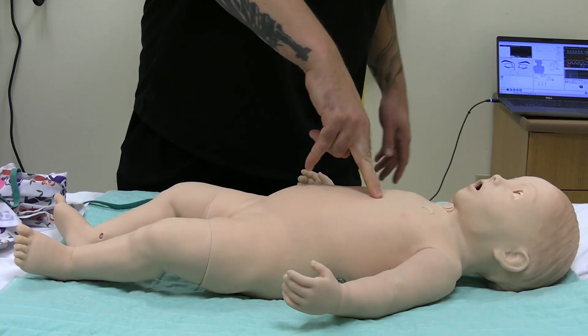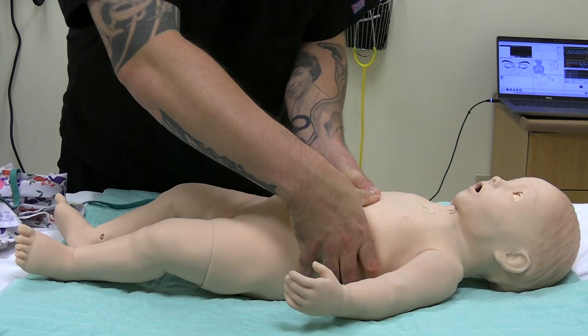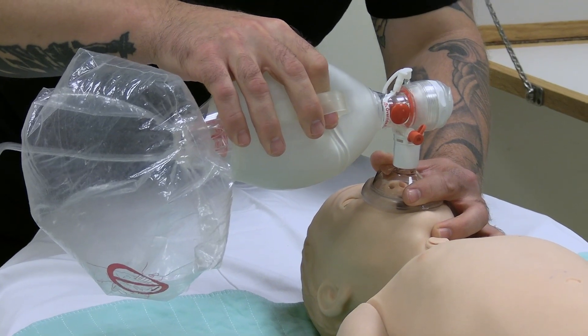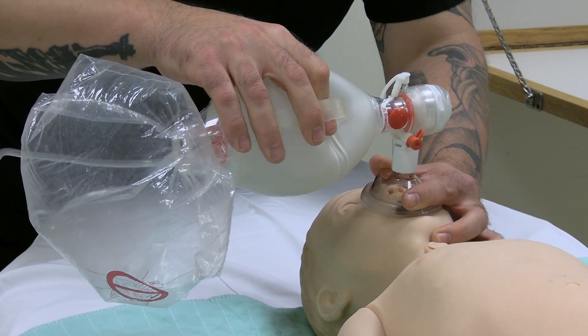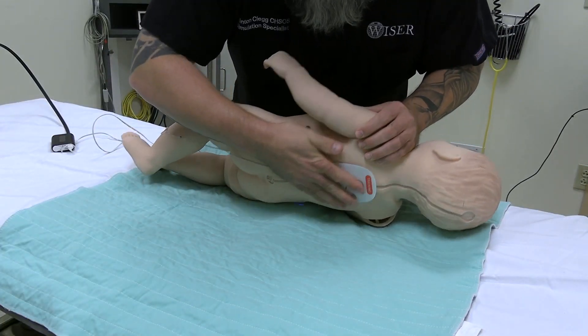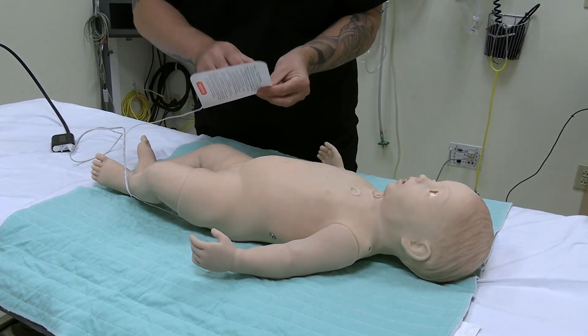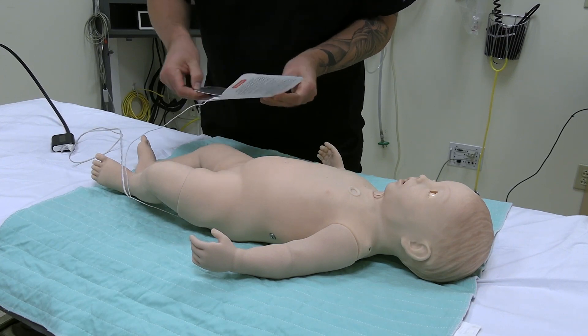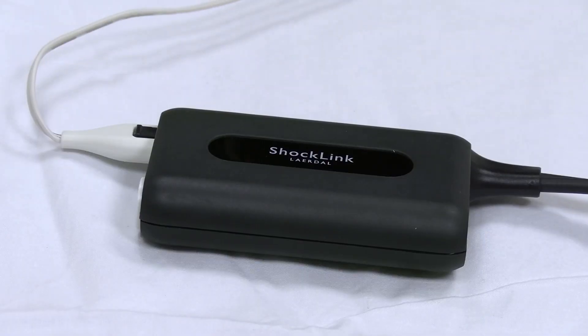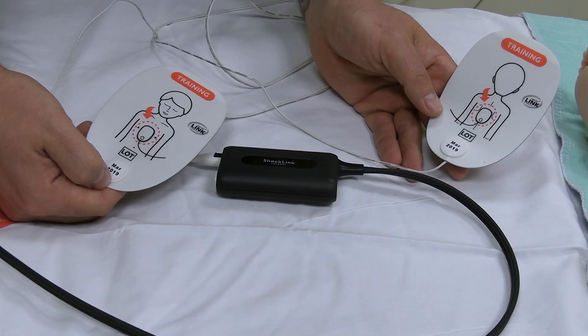Full CPR can be performed on the mannequin. Oxygen delivery devices like bag valve masks, oral airways, and face masks can also be utilized. We can deliver simulated shock to the mannequin for cardiac events using a device called ShockLink. ShockLink is an electric deterrent preventing a live shock from reaching the mannequin, adding an additional layer of protection for the learner.